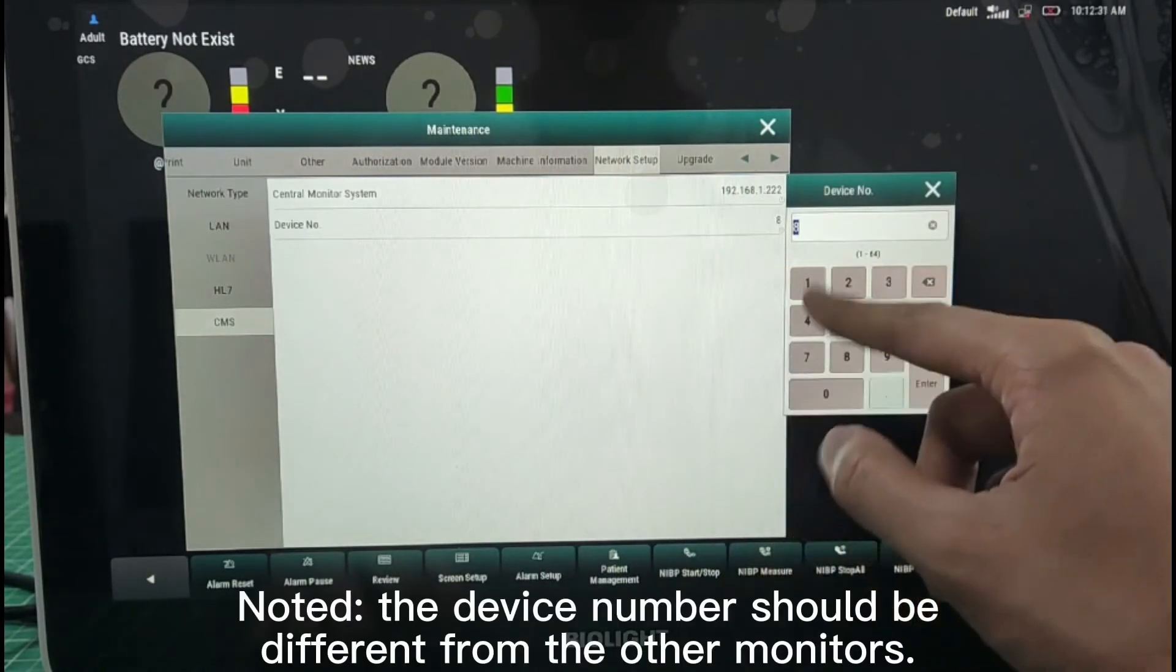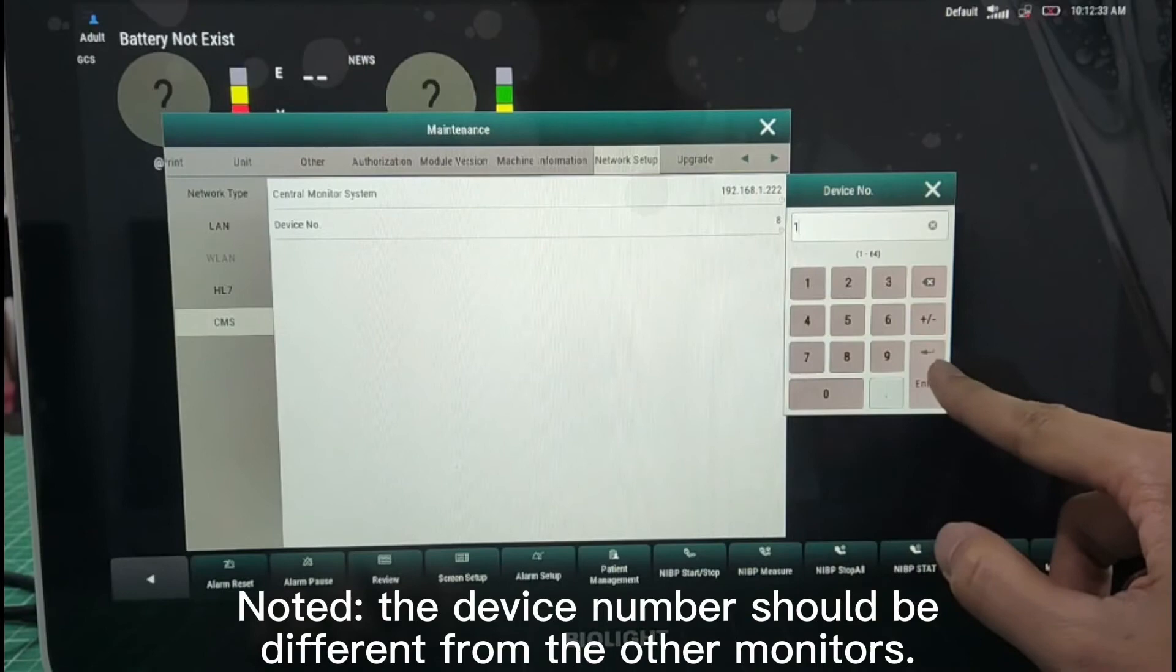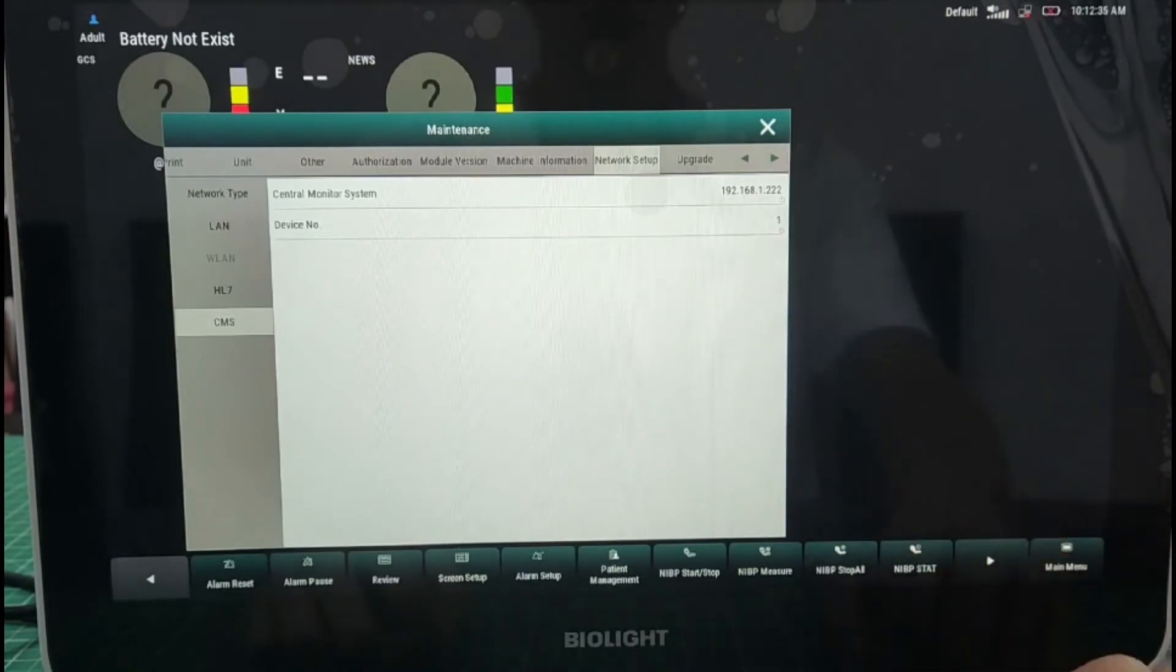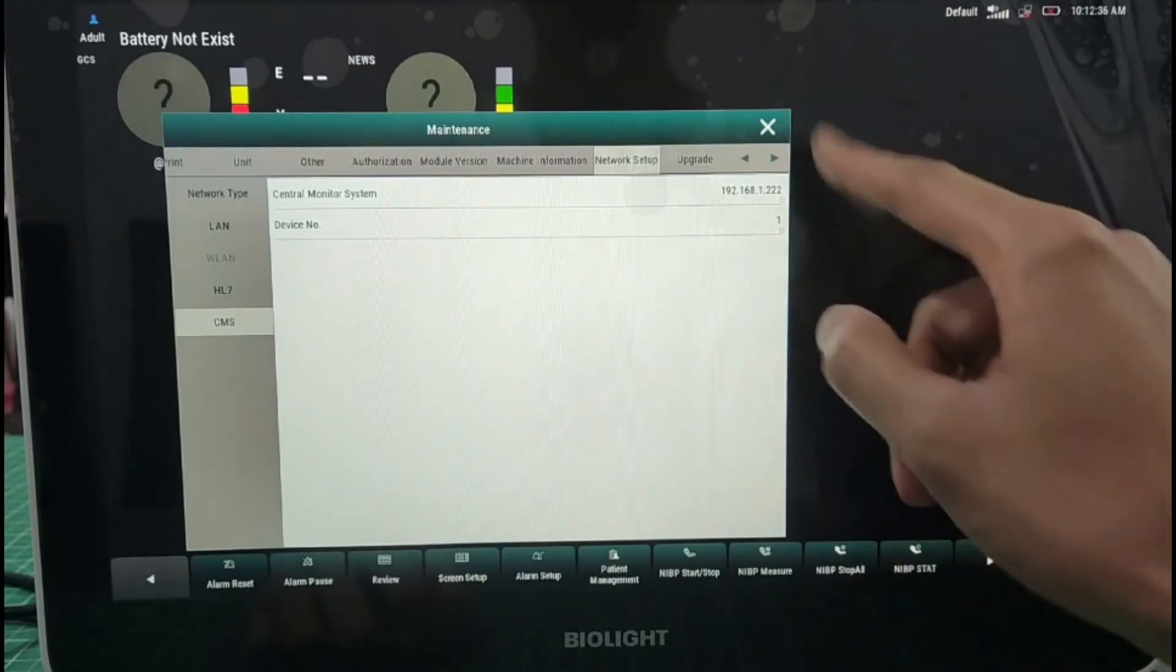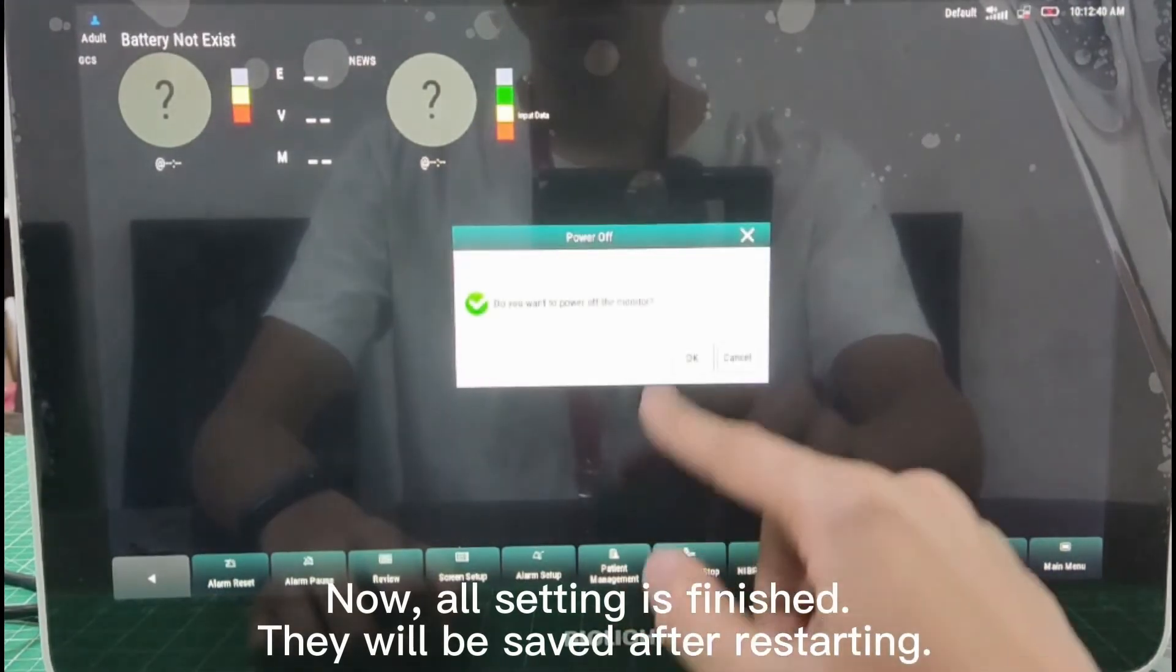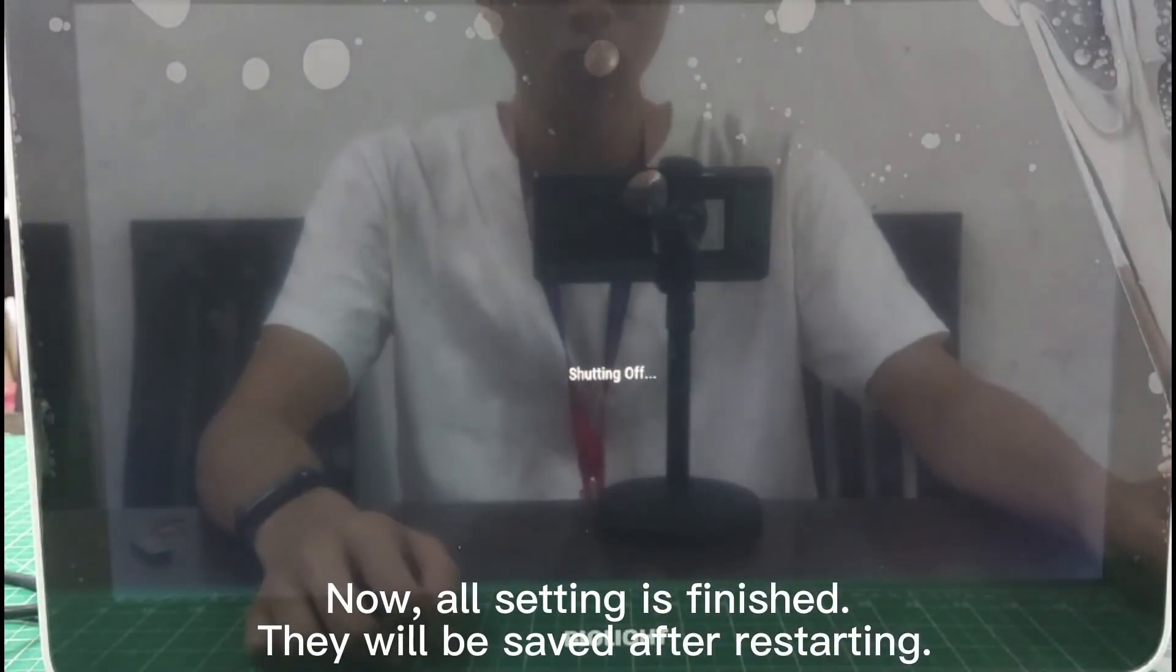Note the device number should be different from the other monitors. Now all setting is finished. They will be saved after restarting.